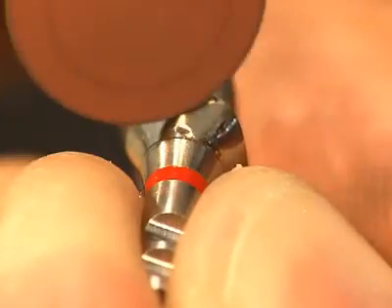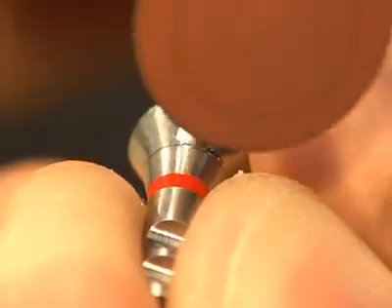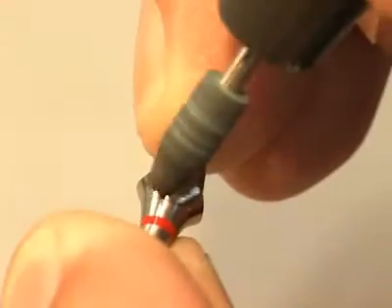After trimming, the finished customized abutment is polished and ready for the fabrication of the cement-retained single crown.